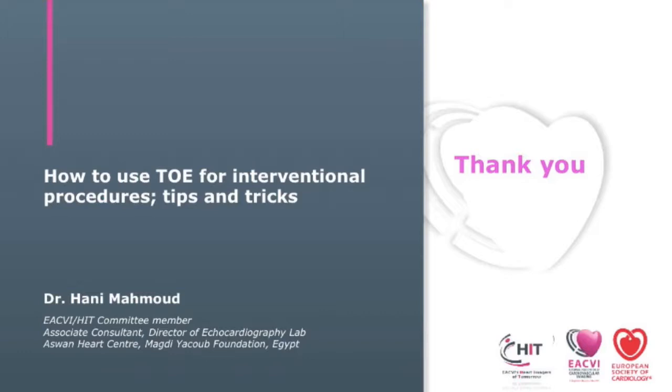This is a very interesting question. I think the key issue is to have a heart team. It is not a one-man show, and I agree that CT and fluoroscopy are cornerstones as well, but because I'm an echocardiographer, I've shown only echo images. For me, you should attend at least 10 supervised cases, and before that see about 5 to 10 cases, so that you encounter some complications and know how to detect them and convey the message to the interventionist and the anesthetist.